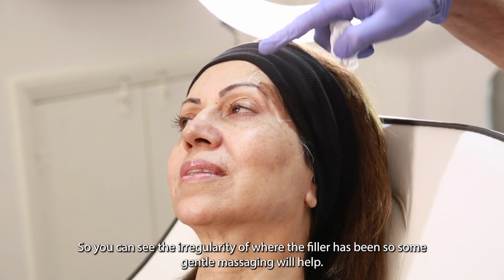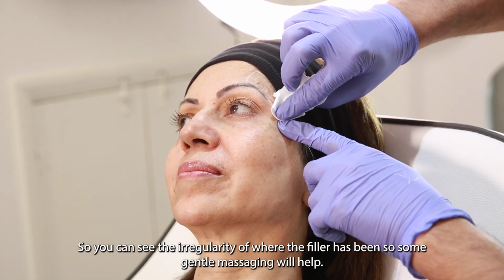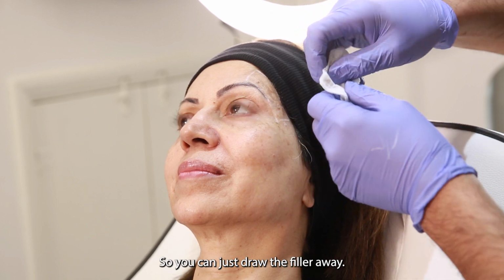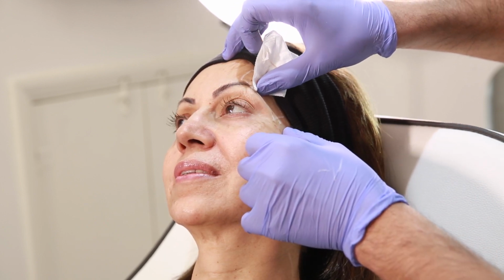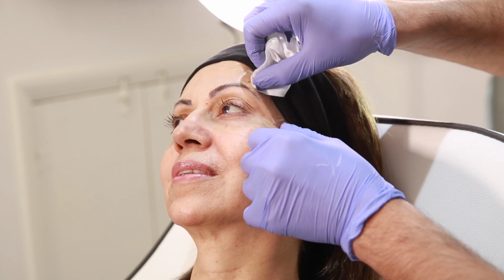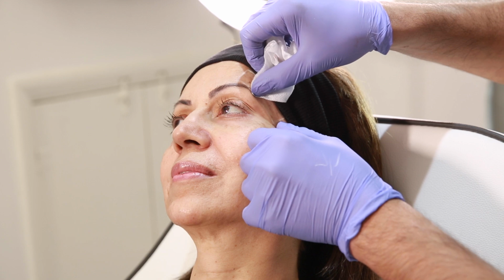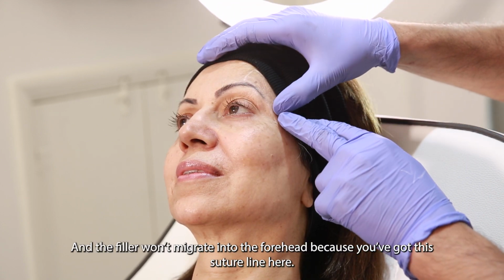So you can see the irregularity of where the filler's been, so some gentle massaging will help. And you can just draw the filler up the way towards your temporal crest. And the filler won't migrate into the forehead because you've got this suture line here.